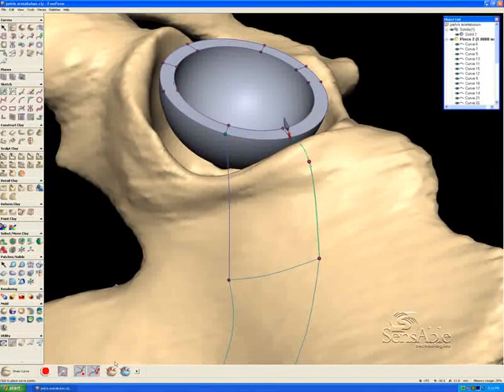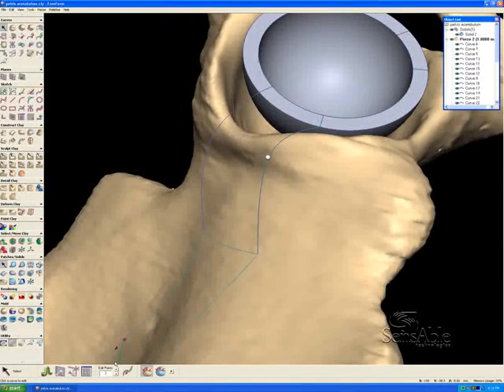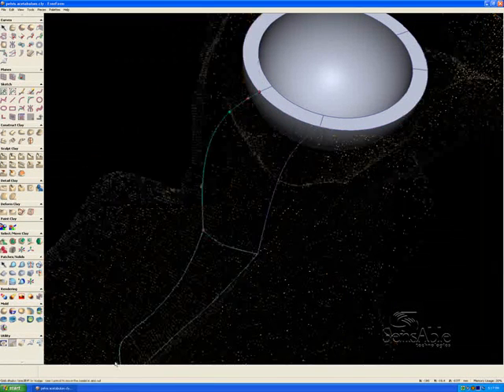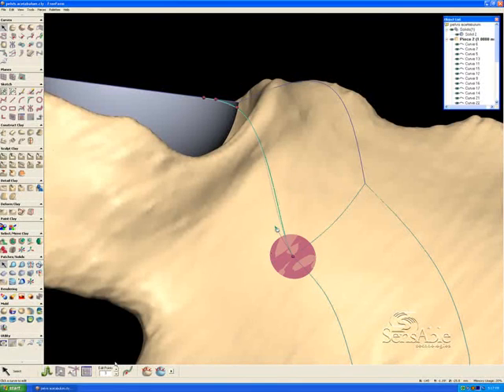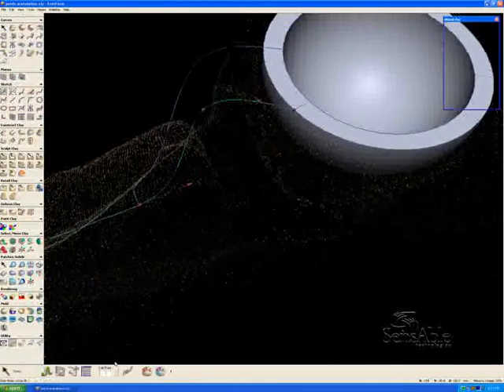So one in the middle and one at the end. And now I'm going to go back into that Select tool and reposition these curves. This is the area of the underside of the tab that will loft over this acetabular periphery ridge. What we're going to do here is just take these tangency handles, and I get that snap when I'm tangent to those adjacent curves as well.